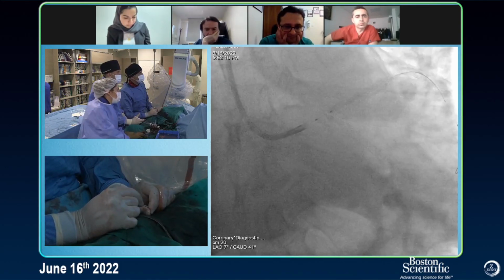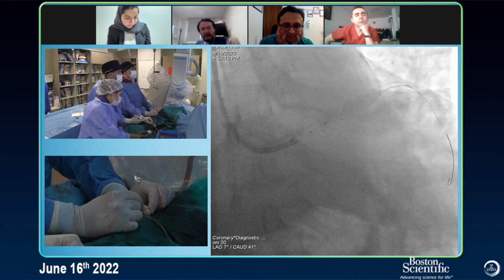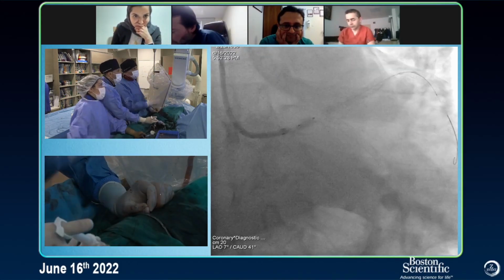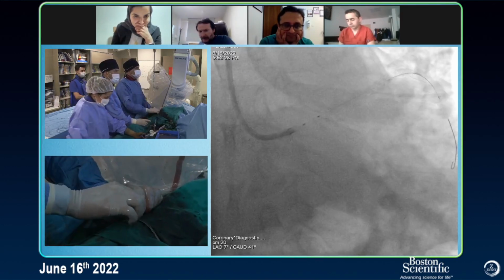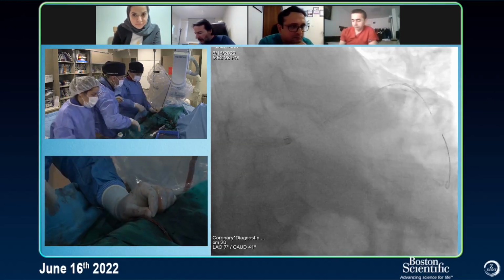Yes, go stent up, it covers the ostium. Test. Yes, here is okay. Go up. 10, 12, 12. Okay, all right. At the end, I recross and I'll do kissing for sure for the circ. But let's focus on the cranial, the diagonal and LAD. Recross the diagonal, do kiss and then do POT all the way.